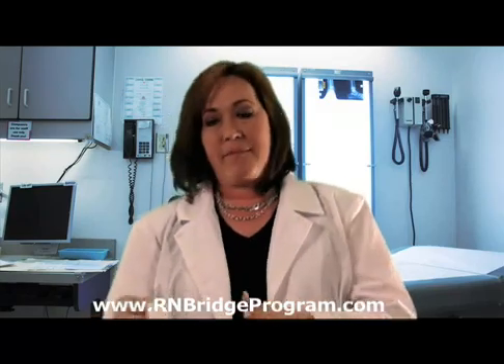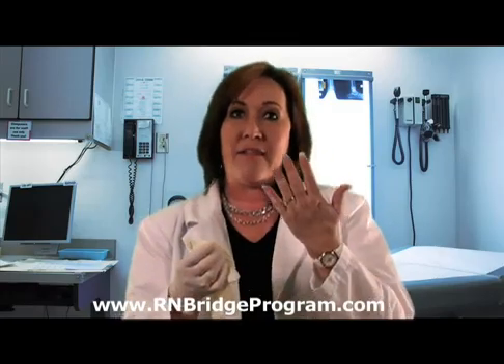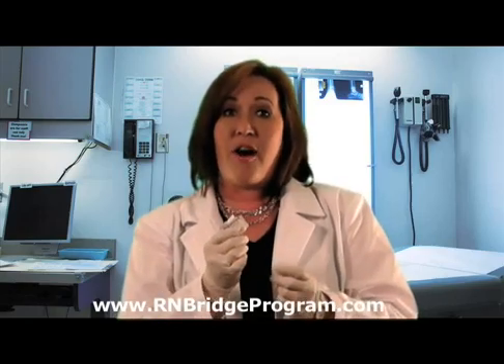Let's go ahead and put our gloves on. When we're talking about asepsis, we're talking about covering our hands with gloves, not having artificial nails such as what I have on — I'm the instructor today with no real patient, but if you had a real patient, nails are a no-no. Even real nails need to be trimmed to your fingertips. Your hands need to be washed prior to the procedure. Then we put these clean gloves on. Once we get the gloves on, we take the alcohol, because another part of asepsis is cleaning the site with alcohol.